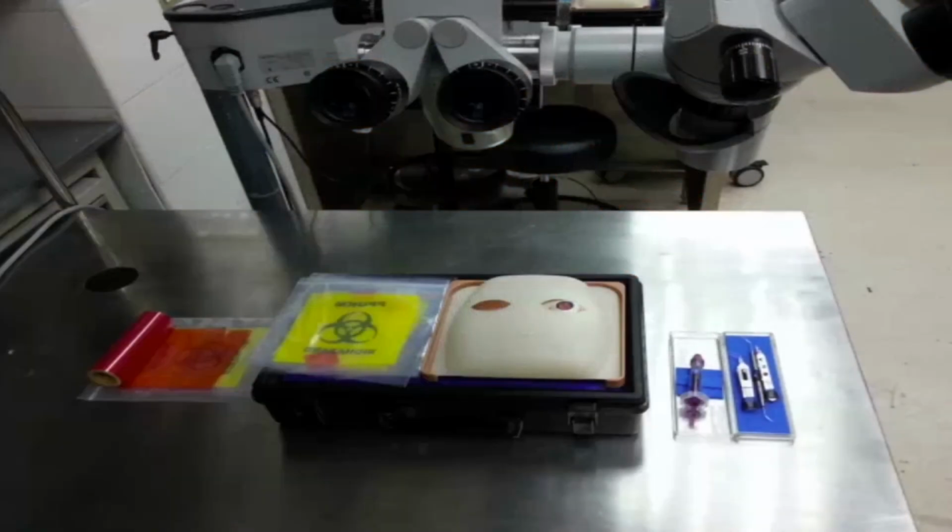So the next step, after you are able to do animal eyes and so on, there is something more economical, but you require a set, a wet lab set. This is the famous Kitaro eye set, for us to practice intraocular surgery.